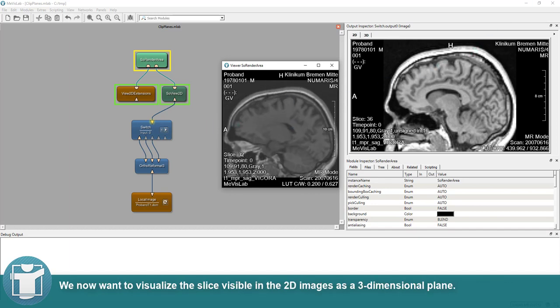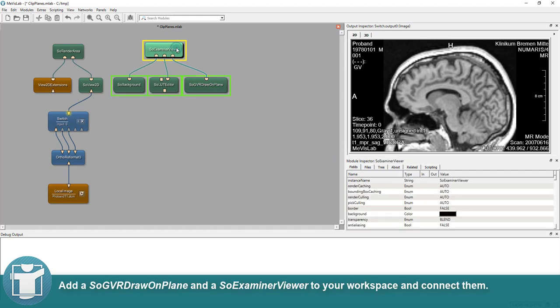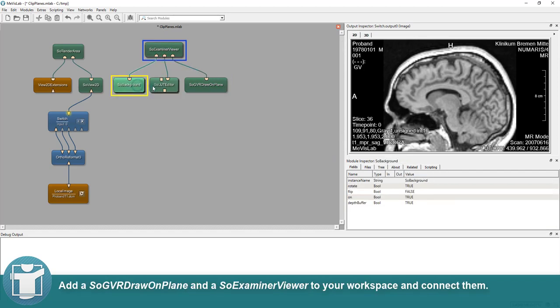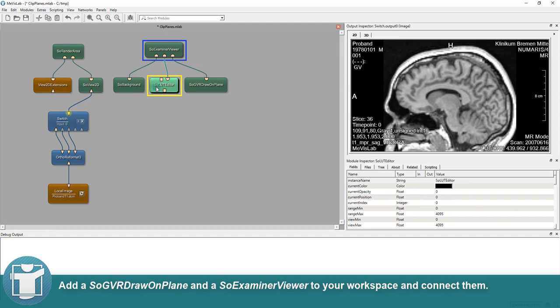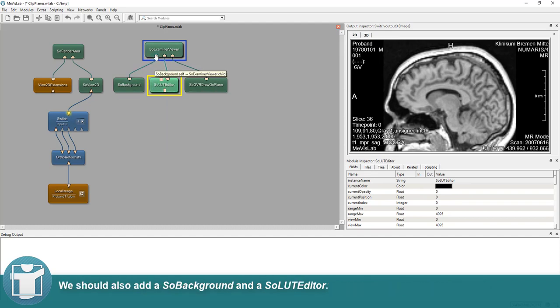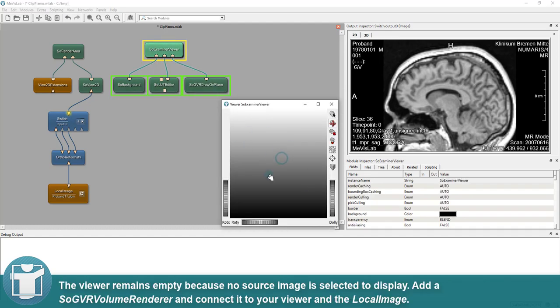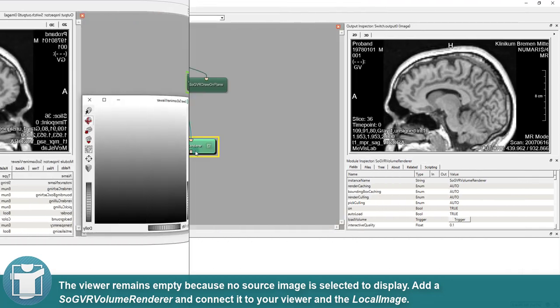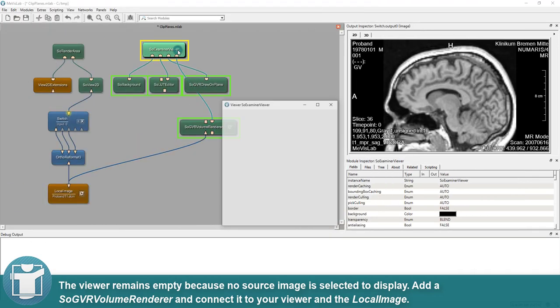We now want to visualize the slice visible in the 2D images as a three-dimensional plane. Add a SO GVR Draw On Plane and a SO Examiner Viewer to your workspace and connect them. We should also add a SO Background and a SO LUT Editor. The viewer remains empty because no source image is selected to display.